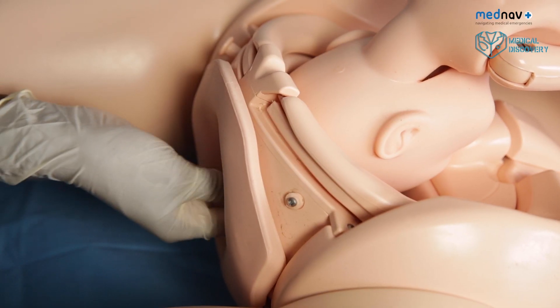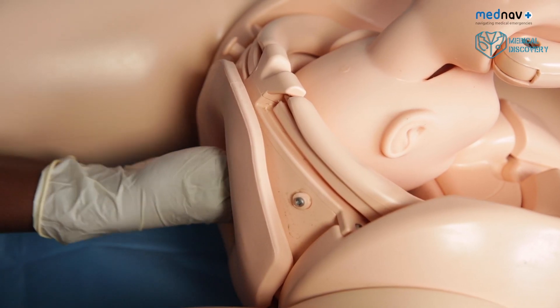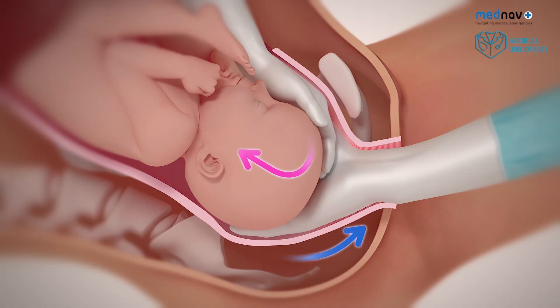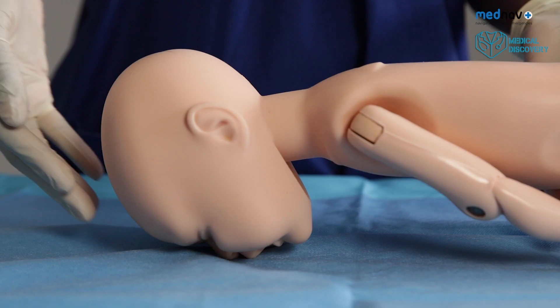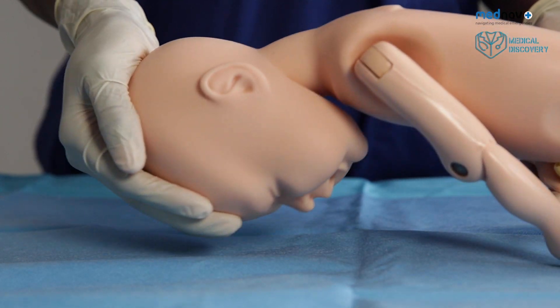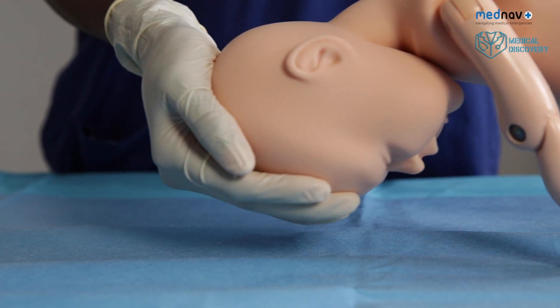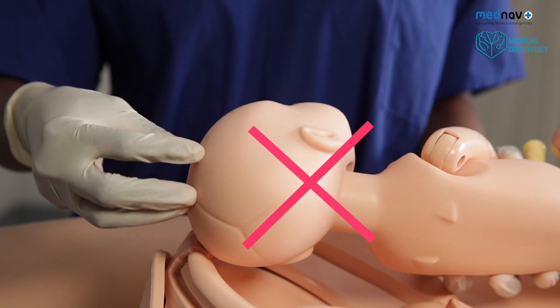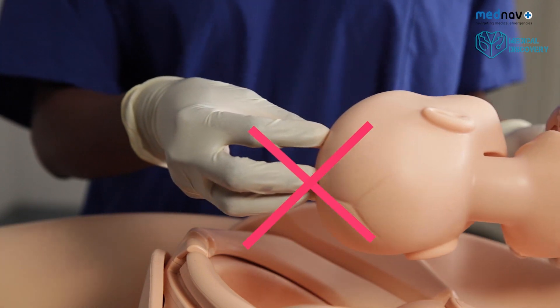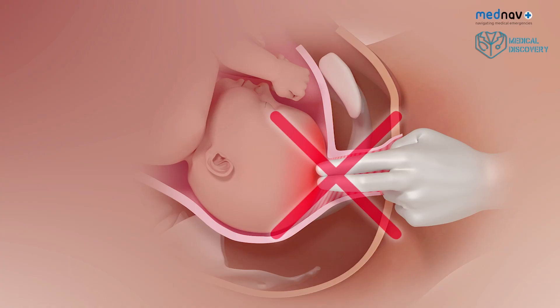Push technique. An assistant can cup the baby's head in their palm and gently flex and elevate the head. Do not apply pressure through your fingers as there is a risk of skull fracture. This should be done by a senior member of staff.